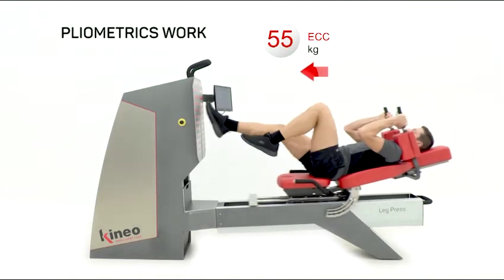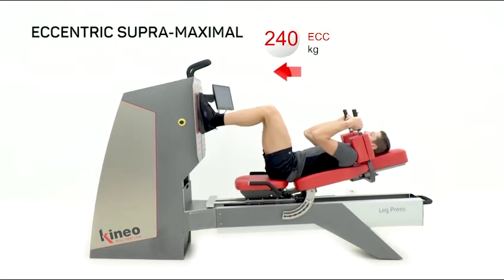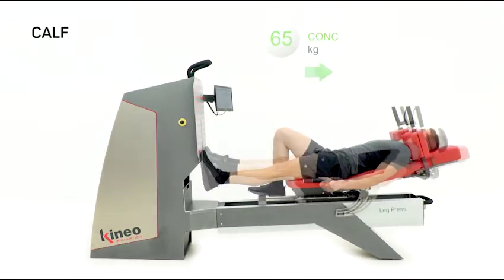With Kineo, it's also possible to work in the return to play phase with one foot or two feet plyometrics, and set up supra-maximal eccentric workouts in complete safety to go back to your sport program.